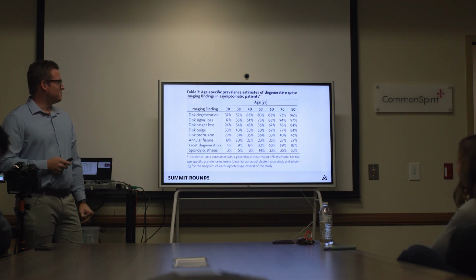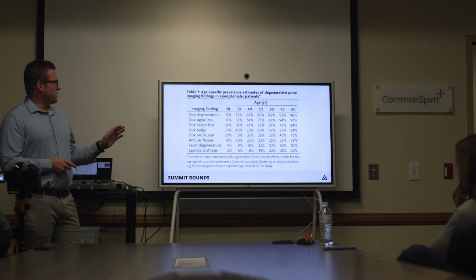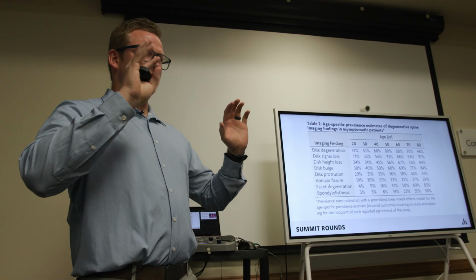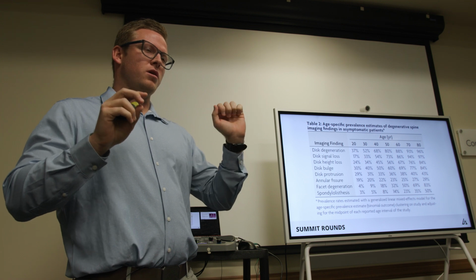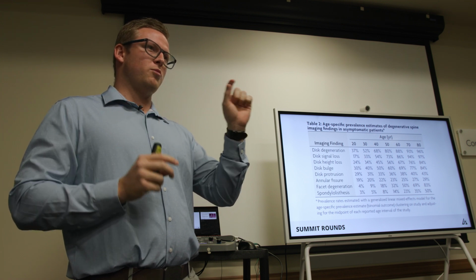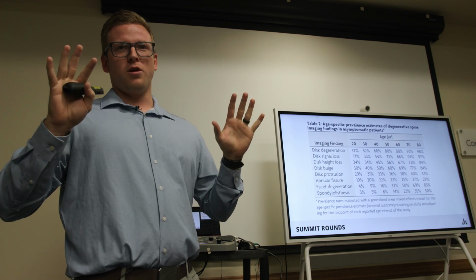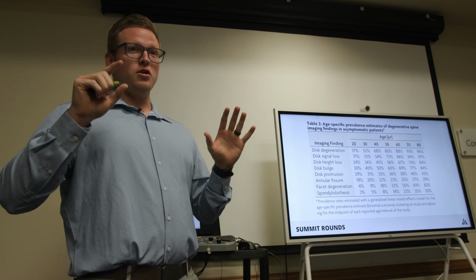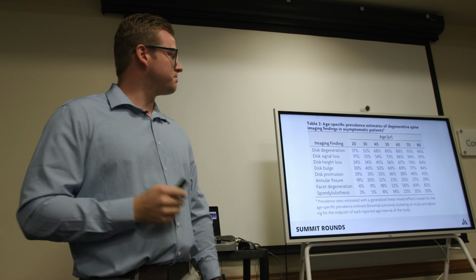And so I think this, combined with diagnostic imaging, combined with diagnostic EMG can be really valuable, because if we see abnormalities on the MRI, but it's unclear if that abnormality we see is the culprit of the patient's symptoms, then we can corroborate that with the function of the nerve from the EMG report and start to complete the picture.